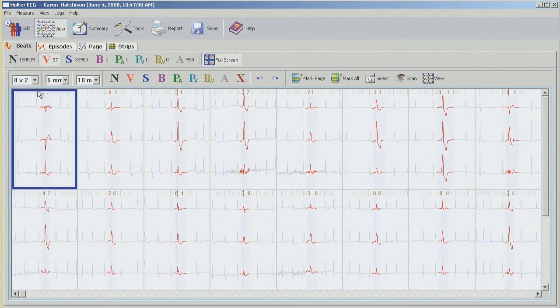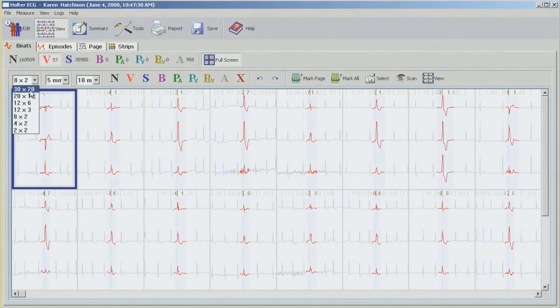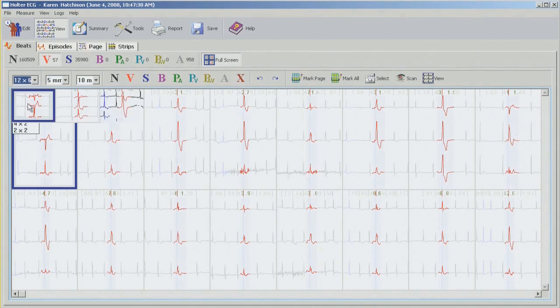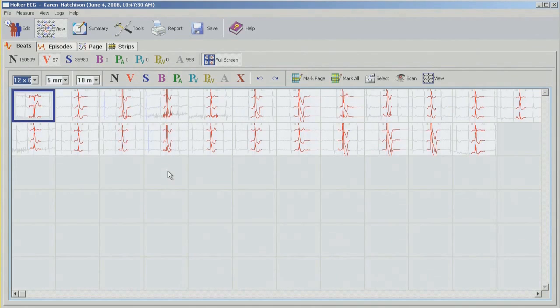And working here, we have different options. If you want to look at 30 by 20 characters, 20 by 10, 12 by 6, and so forth. I'm going to work with 12 by 6.